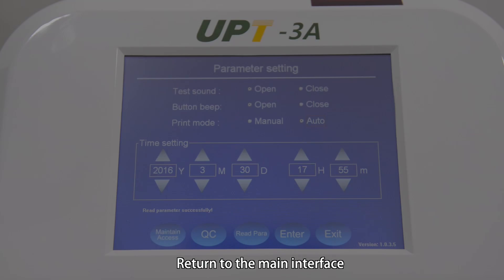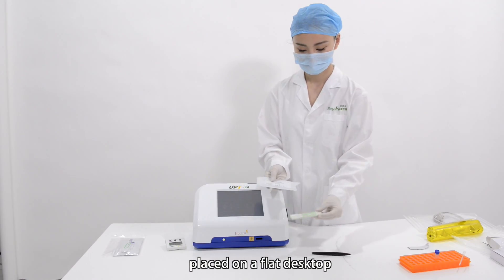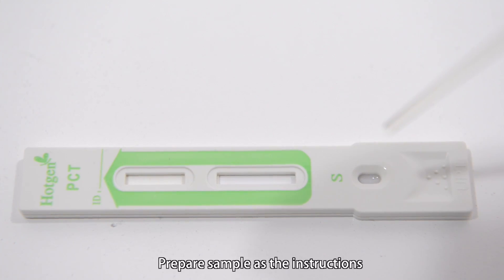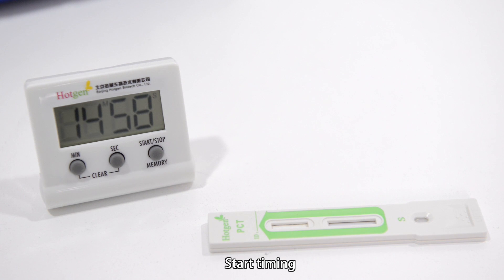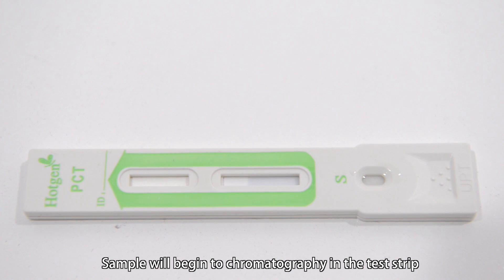Return to the main interface. Second step: take out the test card and place it on the flat desktop. Prepare the sample as per the instructions. Load the sample in the sample well and start timing. The sample will begin to chromatograph in the test strip.